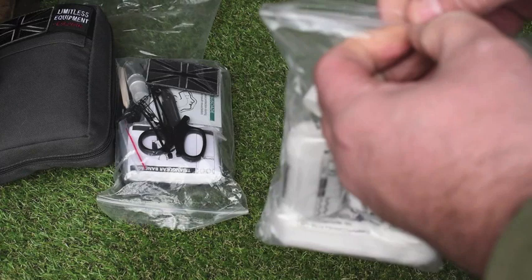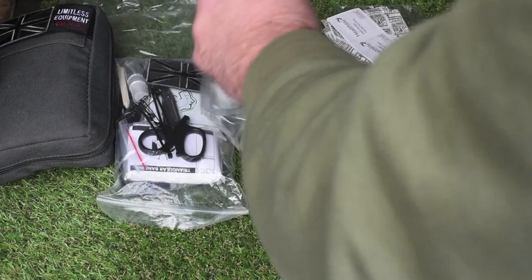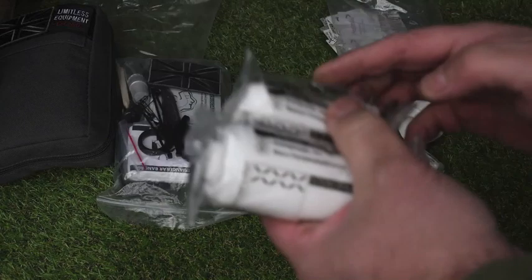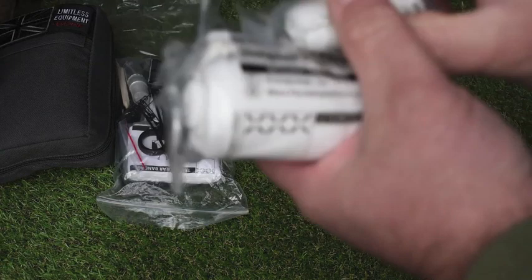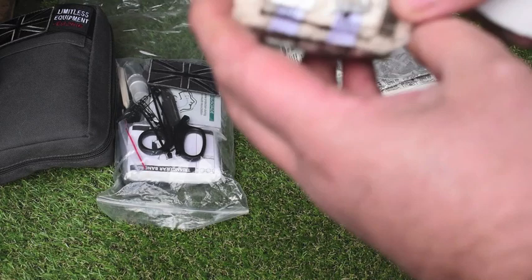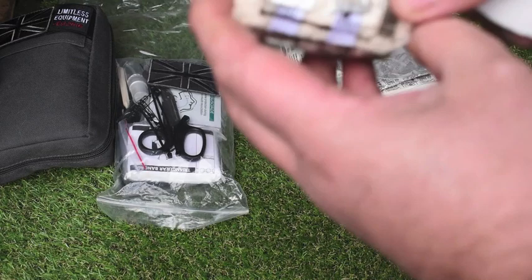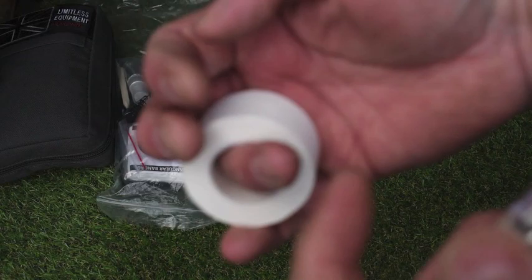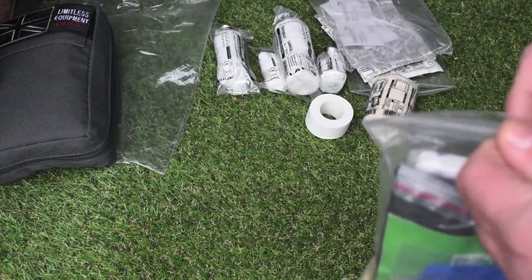The second pack comes in nice resealable zip-lock plastic bags — I like these. In this one we've got different bandage dressings: green dressings in different sizes, 18 by 8 centimetres, 12 by 12 centimetres, and then a smaller dressing. A good varied amount there. We've also got a stretch bandage — you'll have seen these for sprains, strains, and slings. These are really good for putting over your wound dressings too. And the tape is really good. I use this a lot; I tend to get a lot of hacks and cuts on my fingers from my job, so I tape them up a lot. I use that an awful lot — great bit of kit.